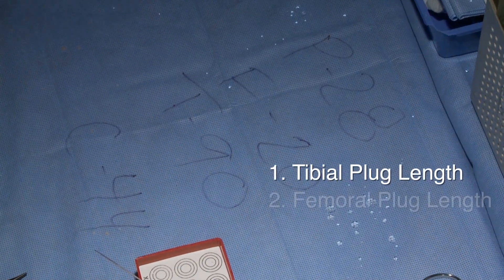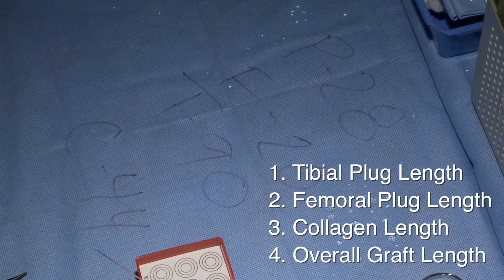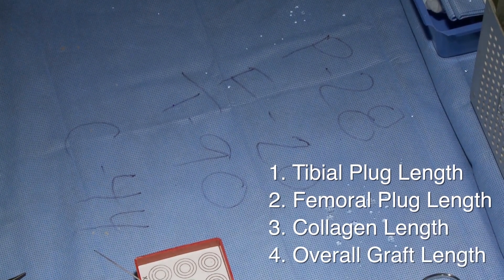It's important to mark down the measurements of the graft. I always write four measurements: the tibial plug length, the femoral plug length, the collagen length, and the overall graft length including both bone plugs.